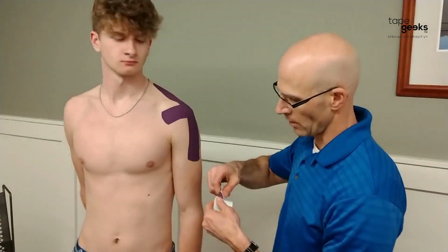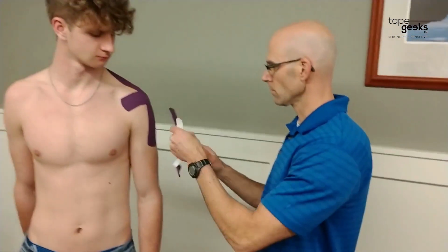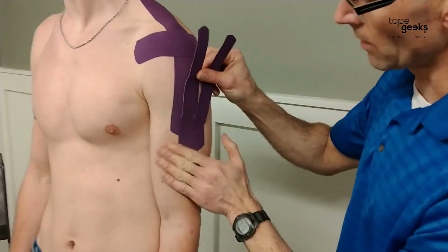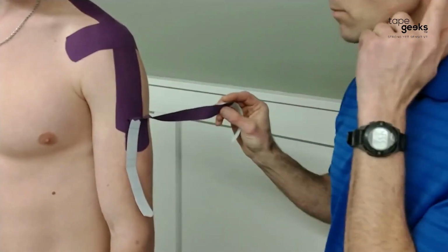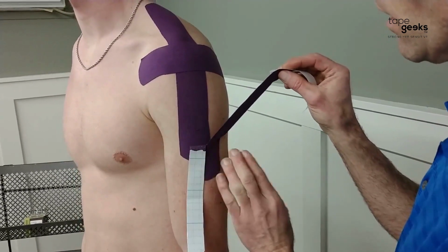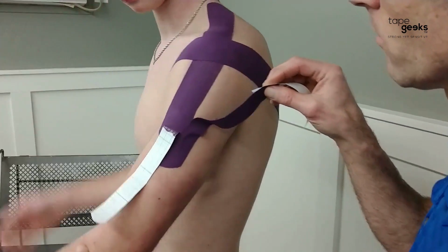Again, removing the tape, pretty easy, just tear the backing like so. Now if you're using more than one piece of tape and you're taping over the top of other pieces, the tape always sticks better on skin versus tape. So I'm going to start this one a little bit lower so I still get some skin going there, lower than the other piece of tape. And also for this, because what I'm doing is in this direction, I'm putting about, say, 15 to 25% tension on it. I want the tissue to be in a little bit of a stretched position, so I'm going to have him bring his arm across in front of him, like that.